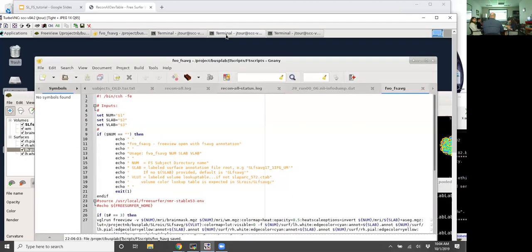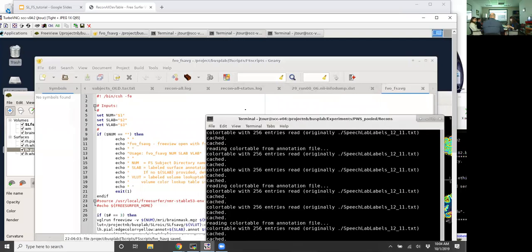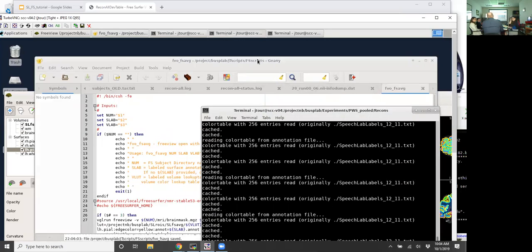Yeah, it can be illuminating. We're sort of spoiled. So far we mainly collect data from adults. When we look at the kids' data, you can see some serious issues, and one of the things we have not spent a lot of time on is what we can do to improve the images before we even use Freesurfer. That's just been a time constraint trade-off. If you become aware of the kinds of problems with the scans, maybe down the road that's something we could look into in future work.